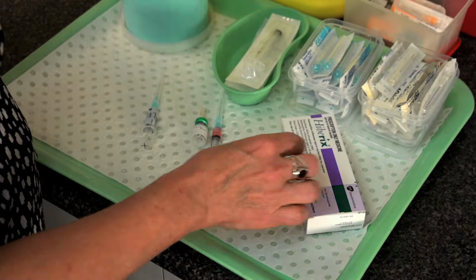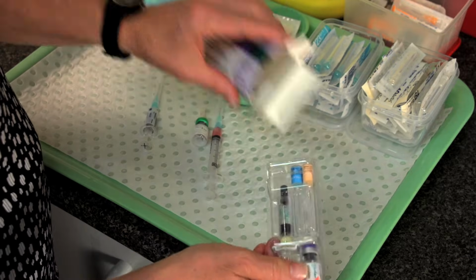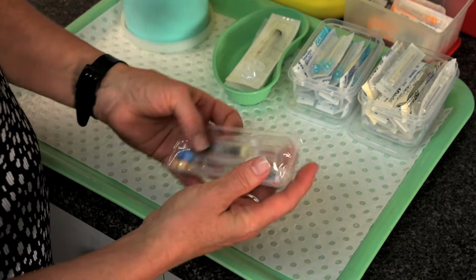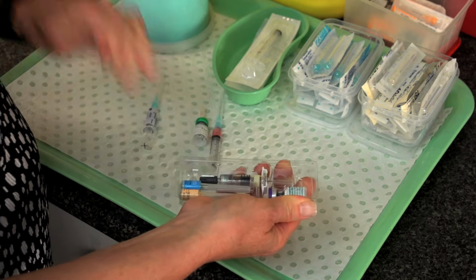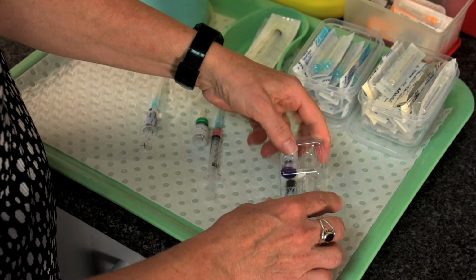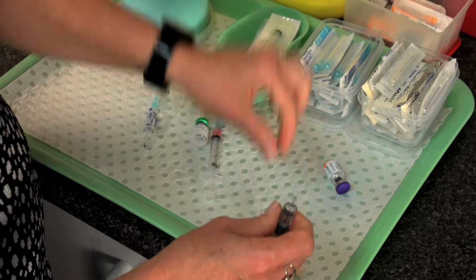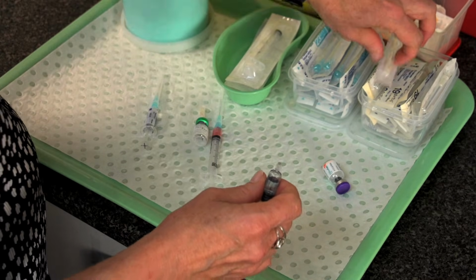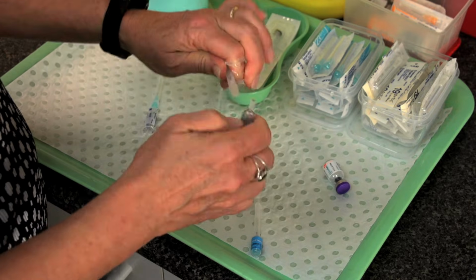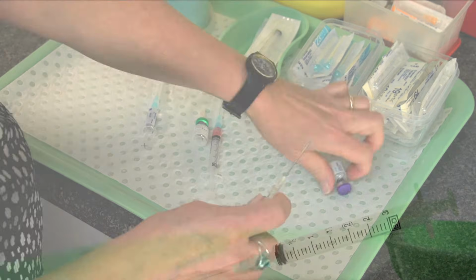Vaccines come in different appearances and presentations. Nurses need to be aware that some vaccines, particularly combination vaccines like Infanrix Hexa, require reconstitution with the syringe and a vial. Other vaccines like MMR and varicella require reconstitution with the supplied diluent. Check for any particles that may be floating and any abnormal colour. Do not use if you are concerned about the contents of the vaccine.